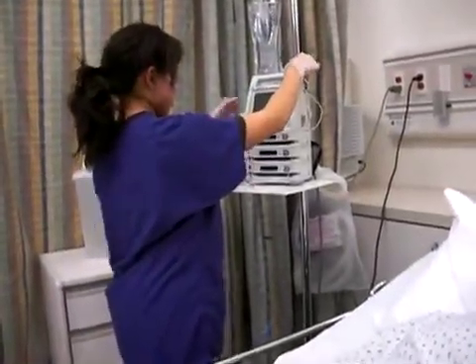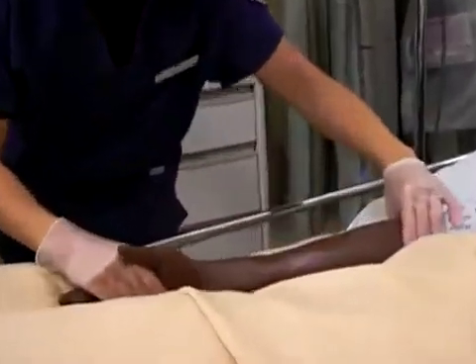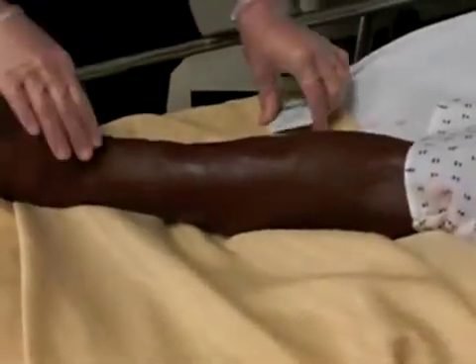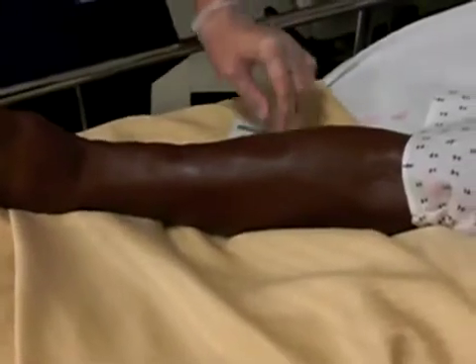The nurse now prepares for the insertion of a peripheral IV. An accessible vein is identified for the placement of the IV cannula. Once the site is identified, usually it's the most distal site and the non-dominant hand is preferred. A tourniquet is applied around the arm 4 to 6 inches above the insertion site.